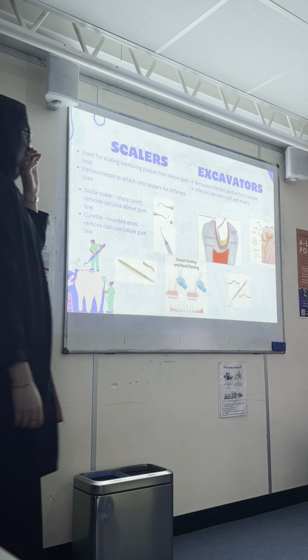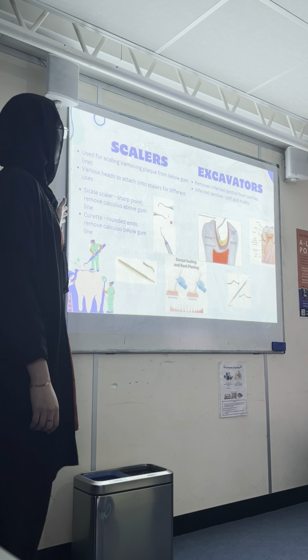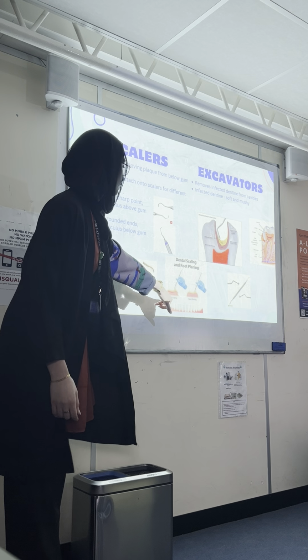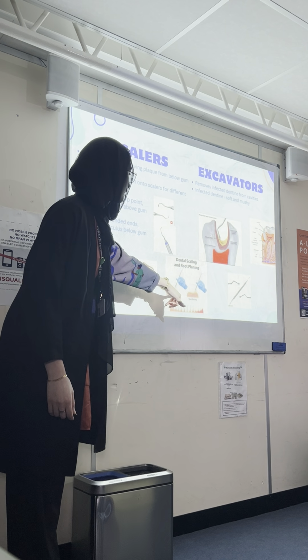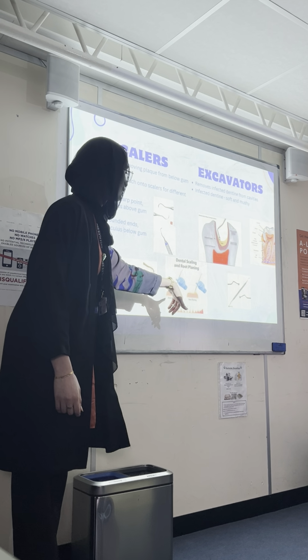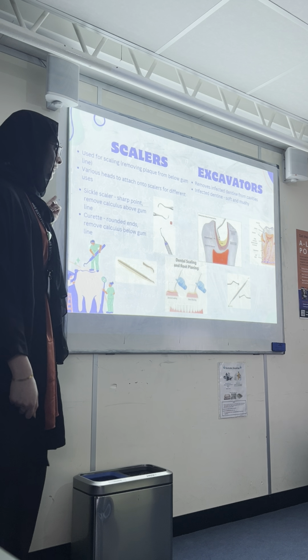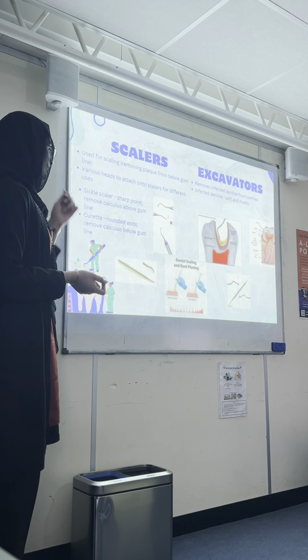Okay, the next tools are scalers and excavators. So they're different in that scalers are used for scaling. So over here you have a tooth and you have plaque below the gum line, and a dentist uses scalers. They can come in with different heads, and a dentist uses them to remove any plaque or buildup. And there are various heads that attach onto the end of it, and they're for different uses.